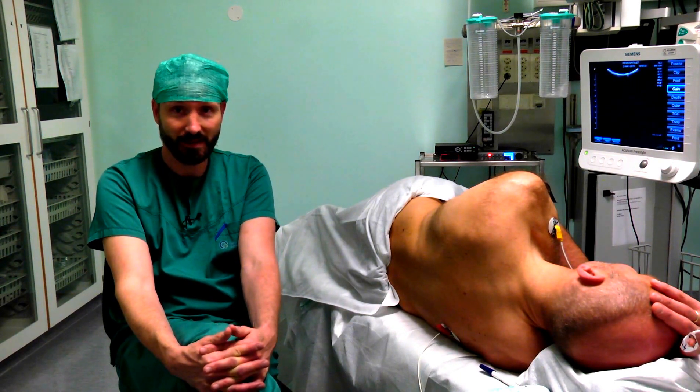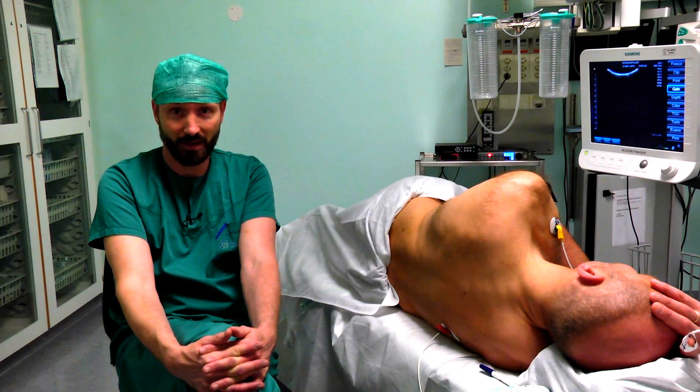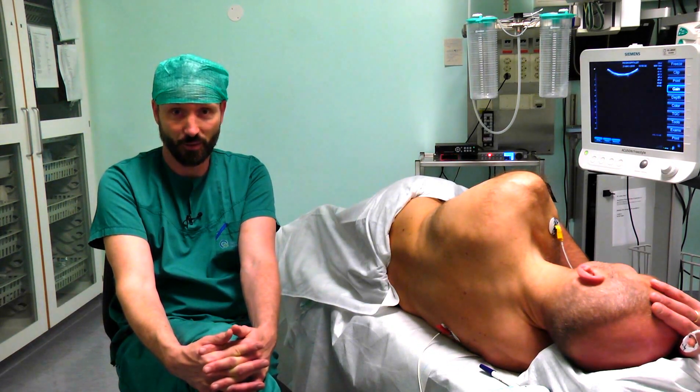Like this, it is quite easy to identify the surrounding anatomy and the nerves of the plexus, and we can obtain good needle visualization when performing the block with this technique.